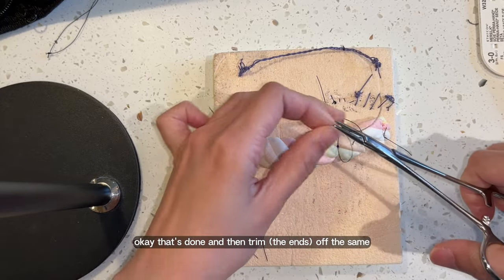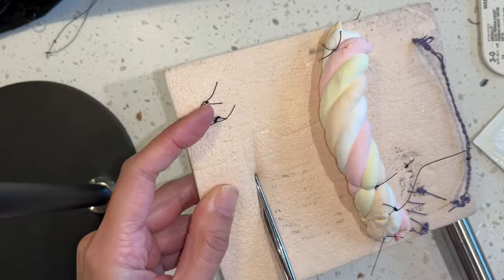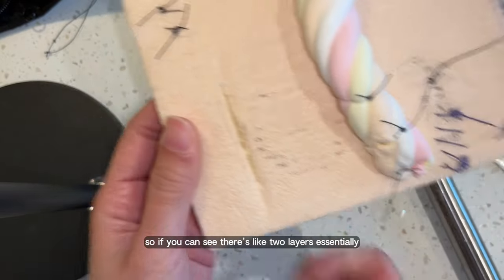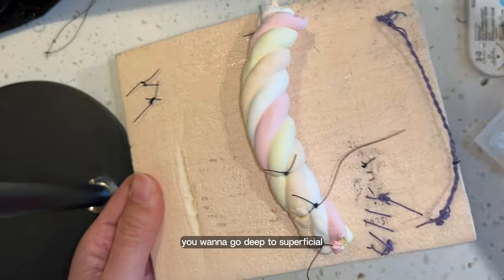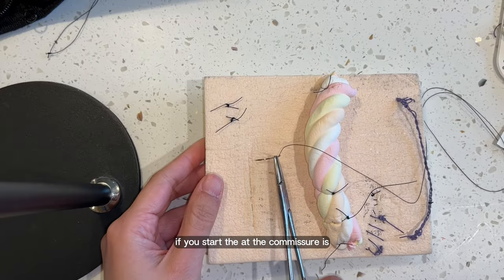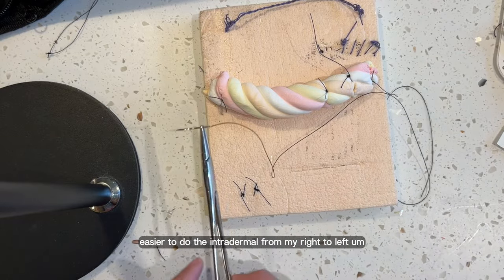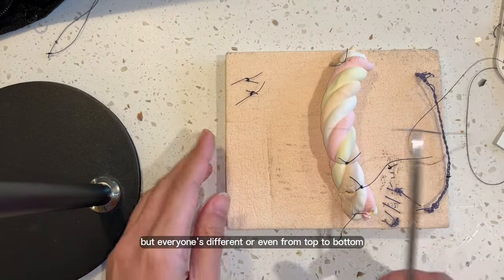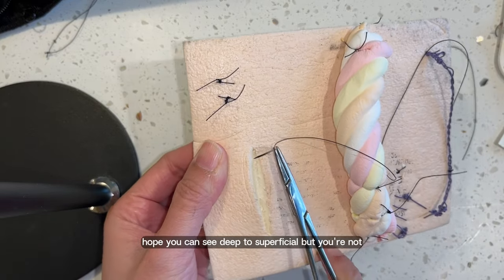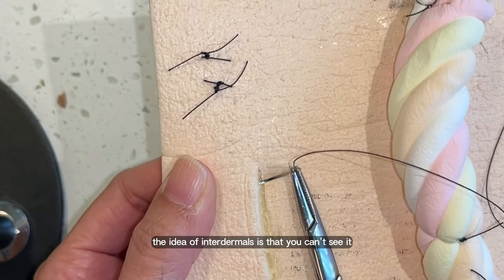Okay, that's done. Trim it off the same. Make a small cut. So you can see you have your epidermis layer at the top and your dermis underneath — there are like two layers essentially. What you want to do is go deep to superficial and then superficial to deep, which I will attempt to show you. Grab your needle holders. If you start at the commissure, I find it easier when the patient is cranial-caudal, and then easier to do the intradermal from right to left. So I'll show you this way. You want to go deep first — so deep in here, deep to superficial. Don't come out on top of the skin — the idea of intradermals is that you can't see it because it's under the skin.